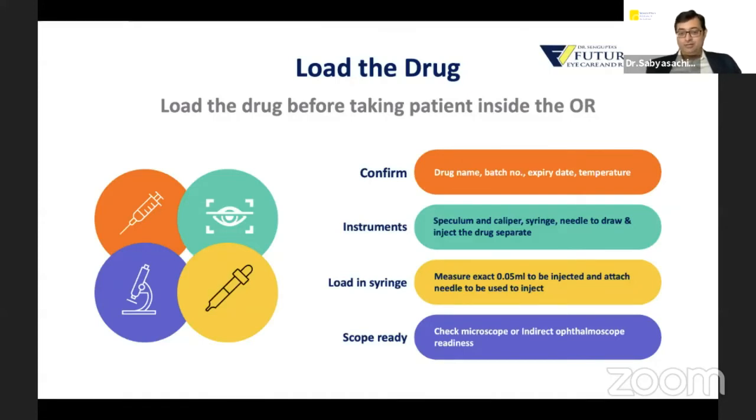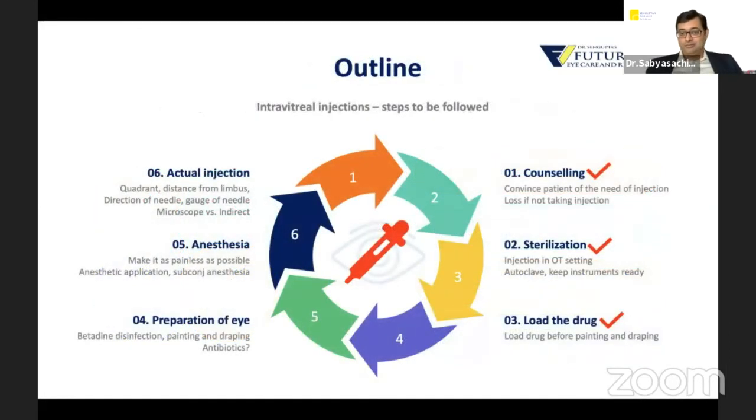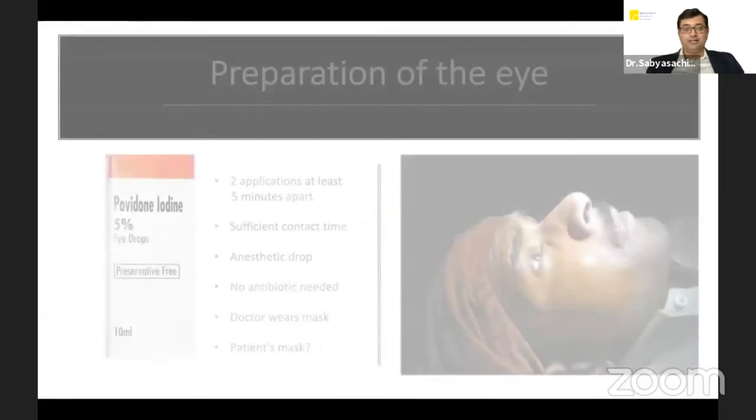And then think about whether you want to use a microscope or an indirect ophthalmoscope, and see that those are ready before the patient walks in. Unless we do these, I have seen a lot of people running helter skelter. Oh, this is not there and that is not there, and it can sometimes be embarrassing. So we were looking at all of this. We've already talked about counseling, sterilization, and loading the drug. Let's see about preparing the eye.